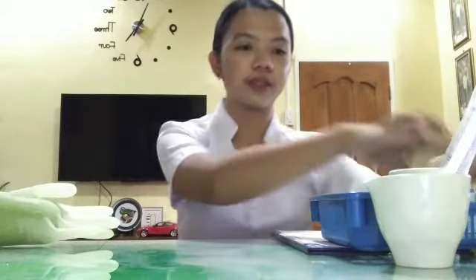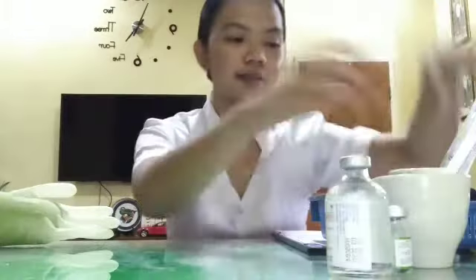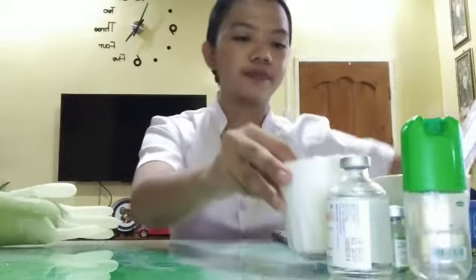So next thing to do is the intramuscular injection. I will just put it back here again.